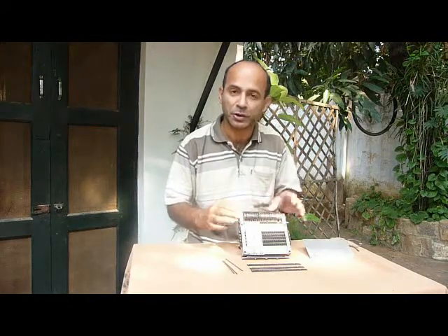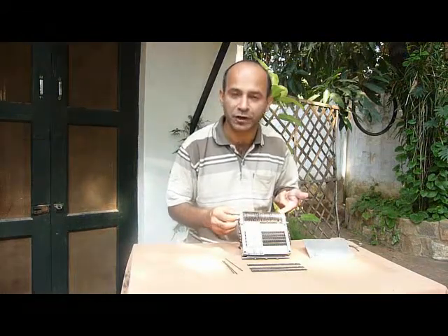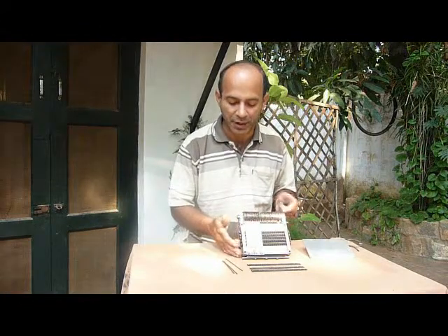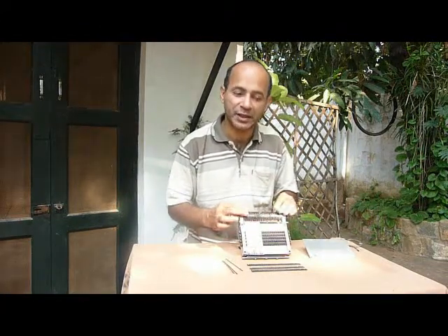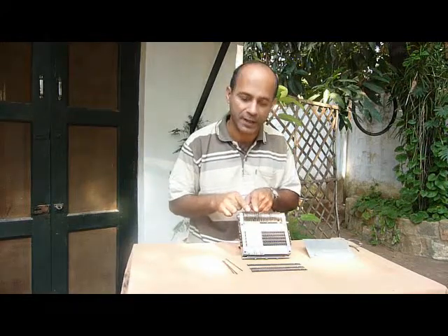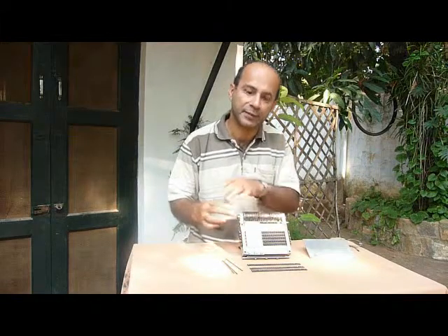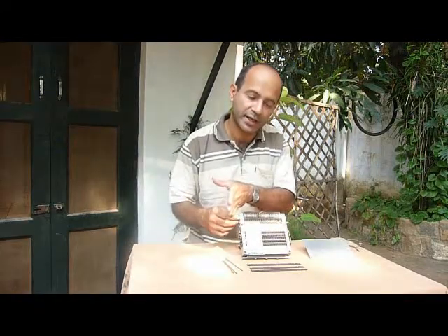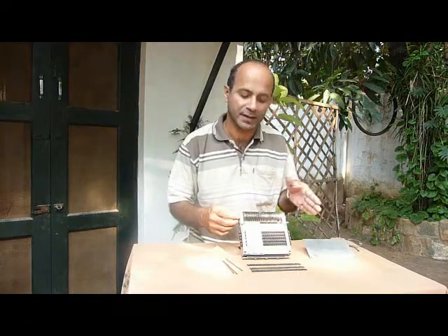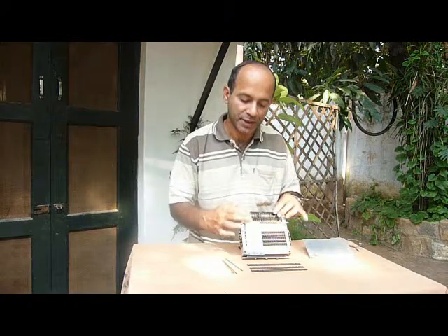The cam is chosen because the actuators are big and bulky, and we would need 40 for the columns and 15 for the rows. And since the columns always follow a sequential pattern of refreshing, we are not doing random type of refreshing here, although it's possible if you have separate actuators for the columns. But if you use a sequential set of enabling for the columns, then you can refresh a page left to right sequentially with one revolution of the bank of cams. So that's what I'm using.